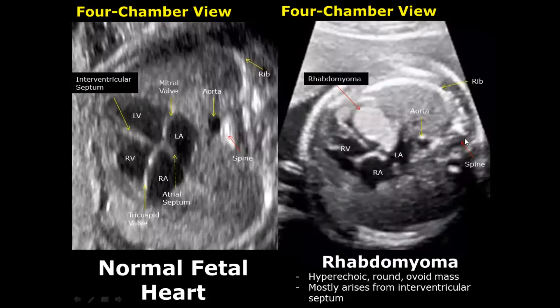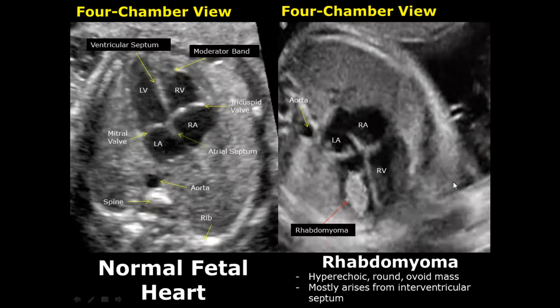A rhabdomyoma is a cardiac tumor that usually arises from the interventricular septum. It will appear as a hyperechoic round or ovoid mass. Here we have another case of rhabdomyoma — a hyperechoic round mass occupying the ventricle.